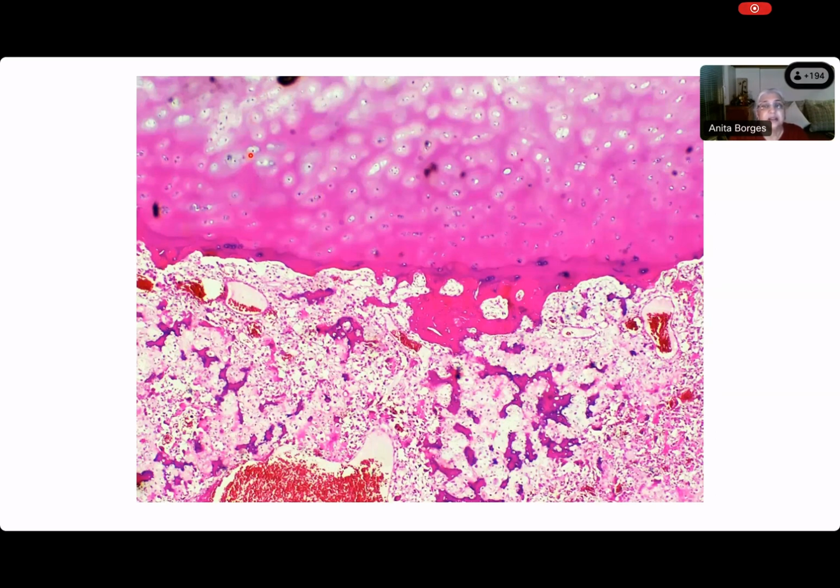This is not bone. It cannot be bone. It has got all these chondrocytes with almost pyknotic nuclei sitting inside lacunae. What other information do you need to call this articular cartilage? I know why you called it part of the tumor, or didn't recognize it as articular cartilage. Because why, Sarangi? Because the color there is more bluish, and here it is more eosinophilic. Yes, because in my mind, cartilage has to be blue, and if it is not blue, then it is not cartilage.